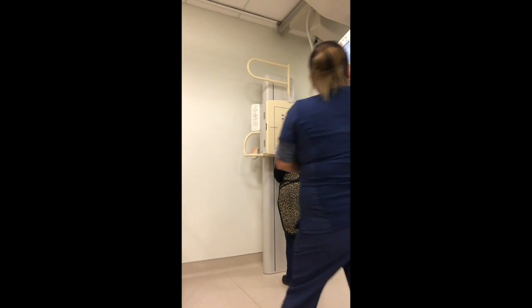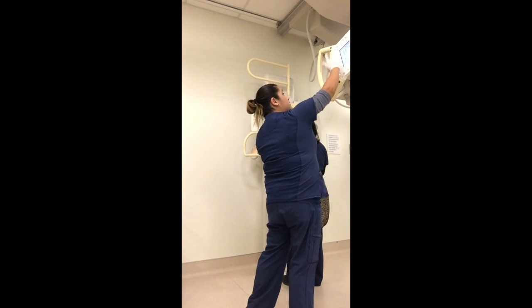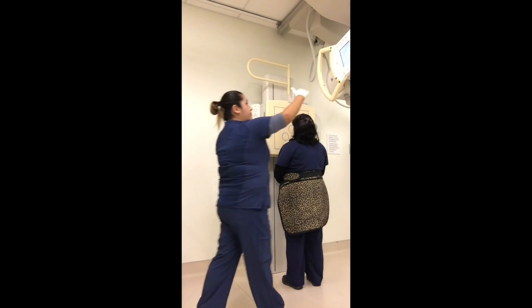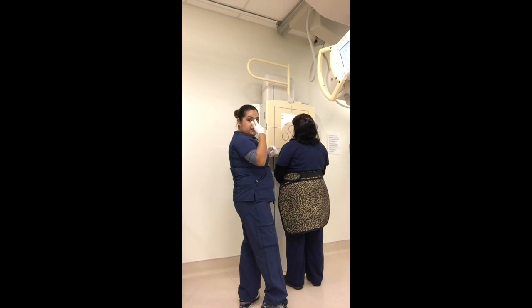So the next projection I'm going to do is my PA axial Caldwell. And I have my tube angled at a 15-degree caudad angle. And my central ray is going to exit at the patient's nasion.